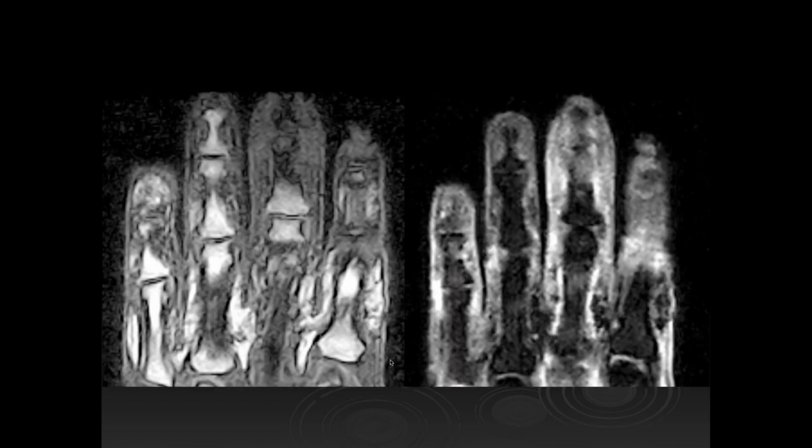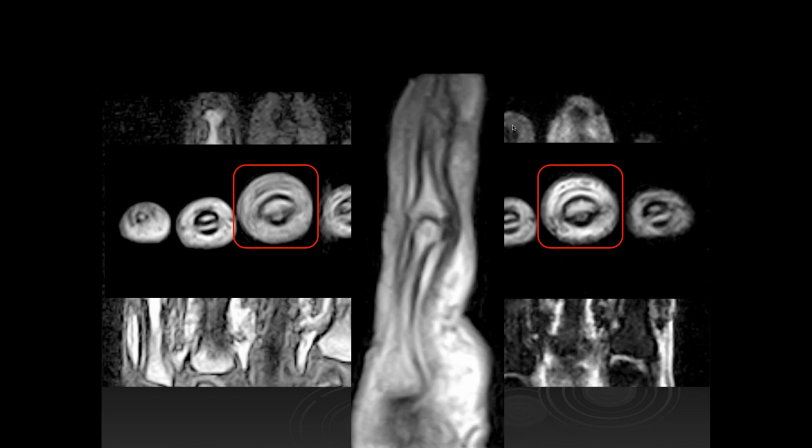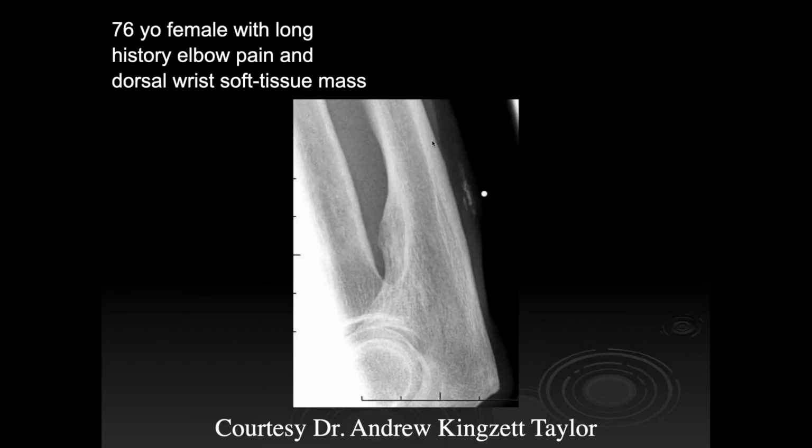Swollen middle finger with skin lesion. Okay, so there's diffuse soft tissue swelling and edema involving that third digit, and it looks like there's increased signal within the distal aspect of the middle phalanx as well as the proximal aspect of the distal phalanx around the DIP joint. So this is probably dactylitis with destructive changes of that DIP joint. Yeah, the one digit is thickened and swollen compared to the others. You can see marked soft tissue thickening here and some arthritic changes within the joints. So this is a typical sausage finger seen in psoriatic arthritis from dactylitis. Good.